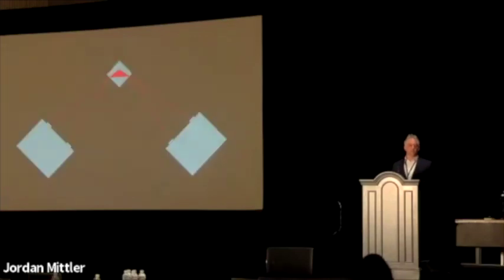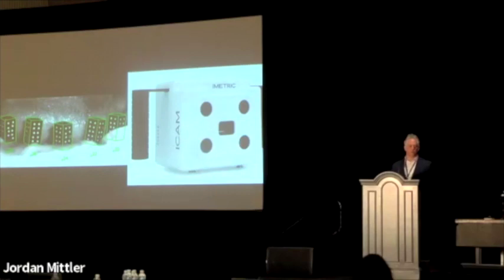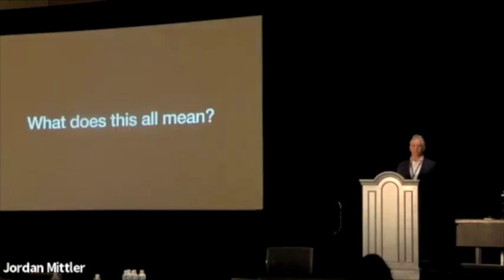So it's just taking different angles and recording those relationships. So again, multiple surfaces. I just find that in my mind, it makes sense that I'm capturing more data with fewer photos. What does this all mean? Why do we talk about this?